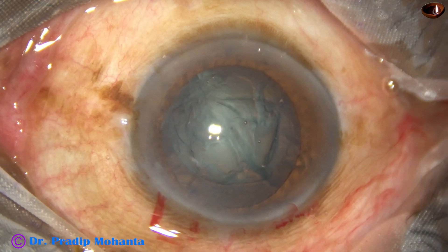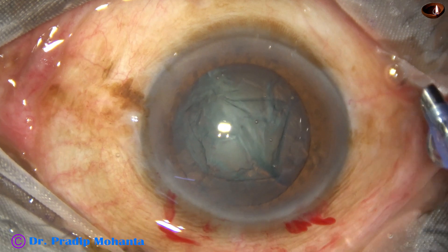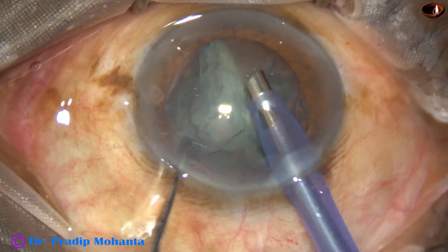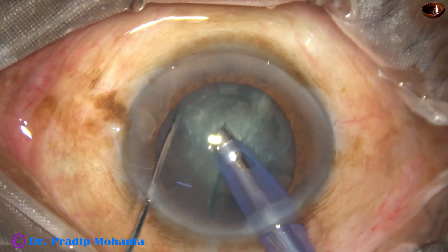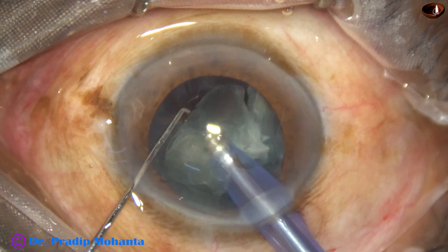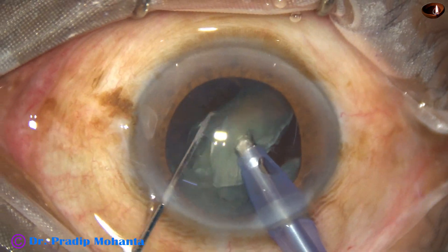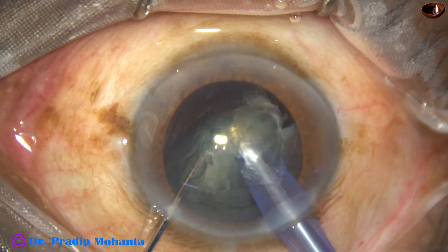The chamber is filled up again and now I introduce the handpiece. The tip of the handpiece is introduced, beveled down. Some superficial cortical lens matter is removed. Now each hemi-nucleus is chopped and the fragment is emulsified. Ultrasonic energy used is 60%, flow rate is 45 ml per minute, and vacuum is 450 millimeters of mercury.